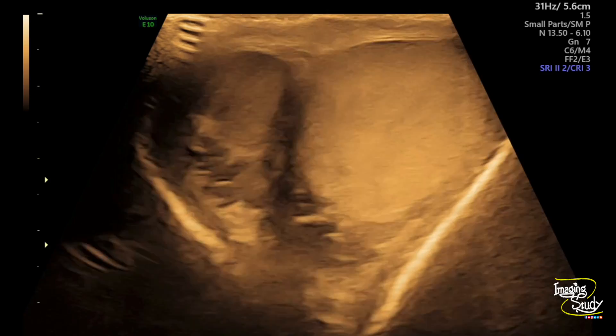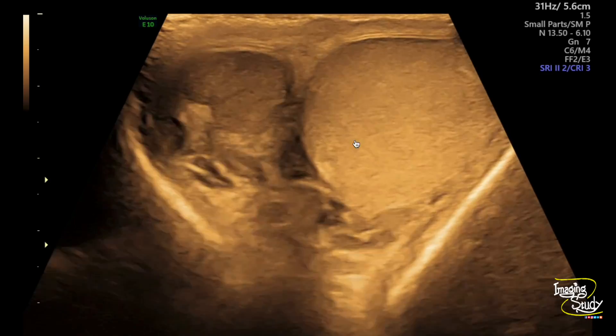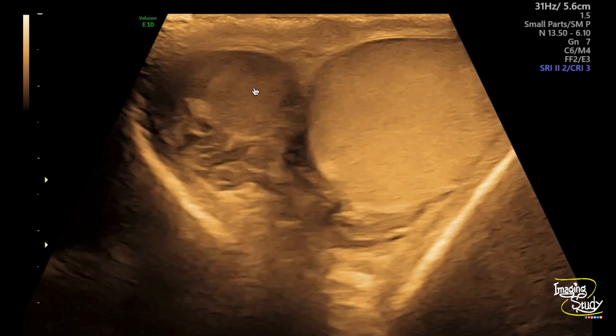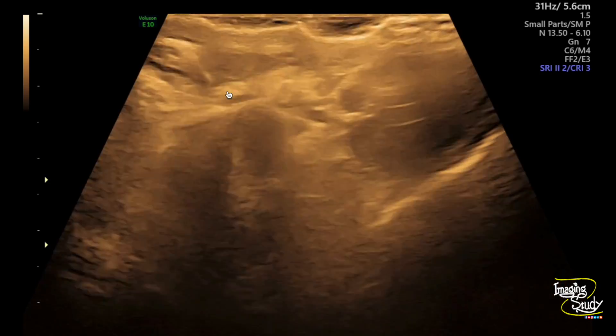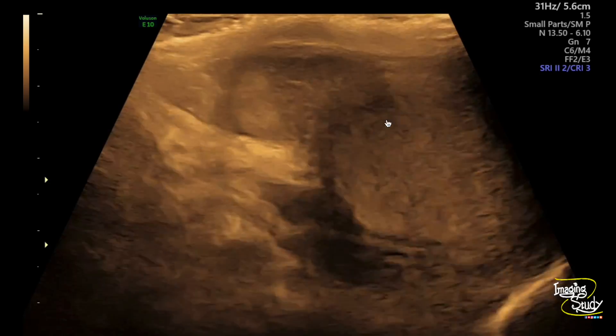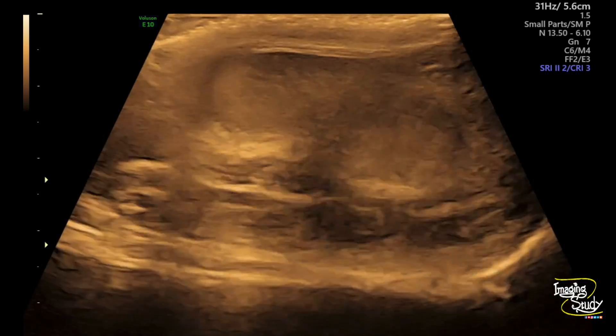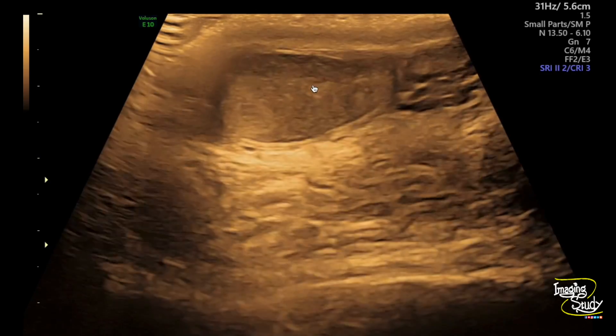Here's the transverse section. You can see the right testis is relatively smaller and heterogeneously hypoechoic in comparison to the normal left one. There is no definite calcification seen here.